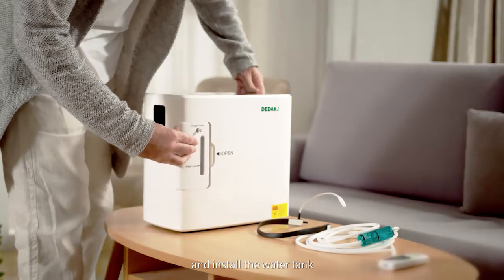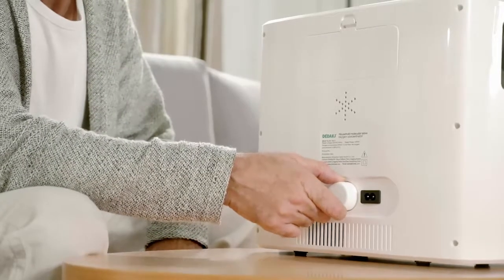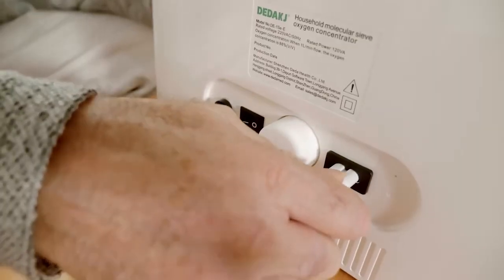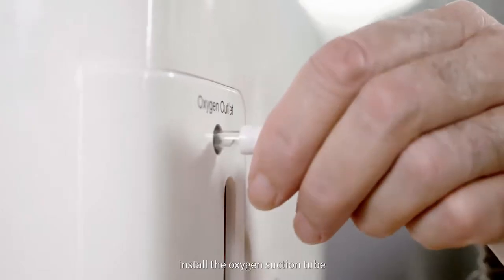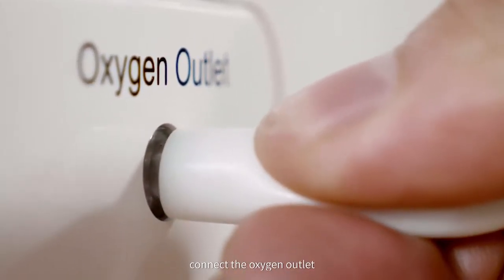Install the water tank. Check whether the air filter is installed in place. Connect the power plug. Install the oxygen suction tube — the bigger mouth side of the oxygen tube connects to the oxygen outlet.